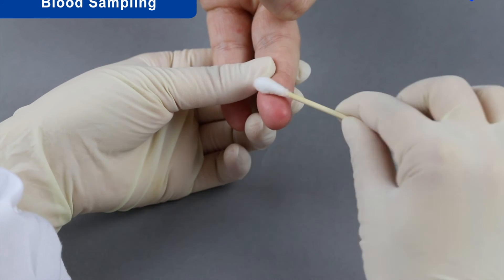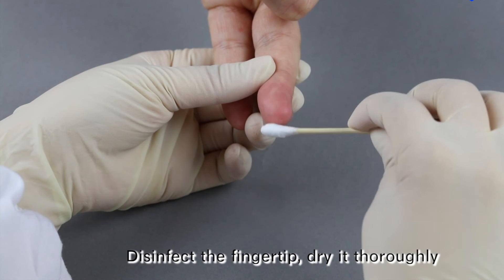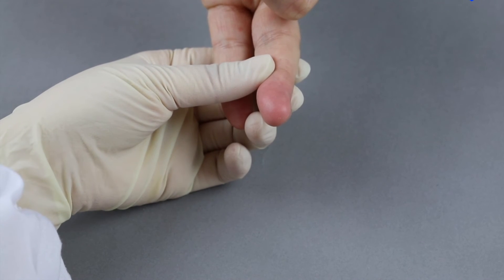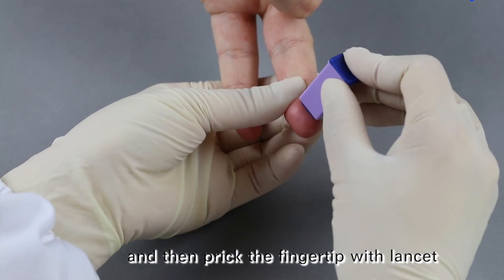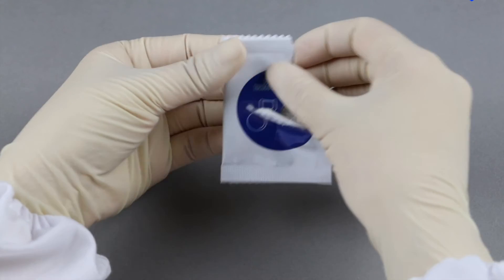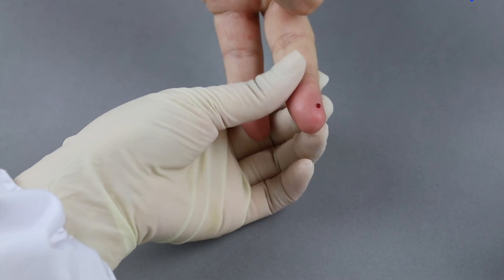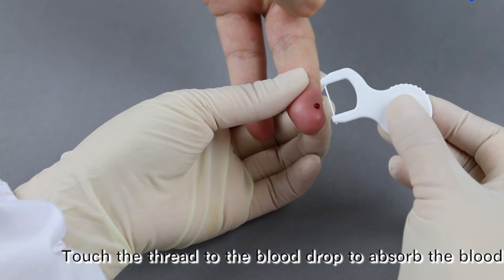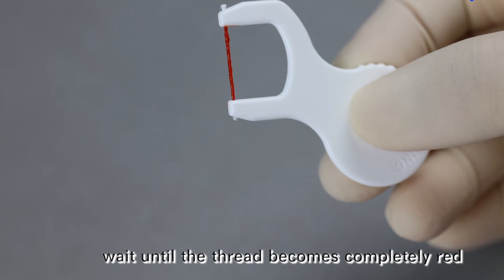Blood Sampling. Disinfect the fingertip and dry it thoroughly. Prick the fingertip with a lancet. Take out a sampler and touch the thread to the blood drop to absorb the blood. Wait until the thread becomes completely red.